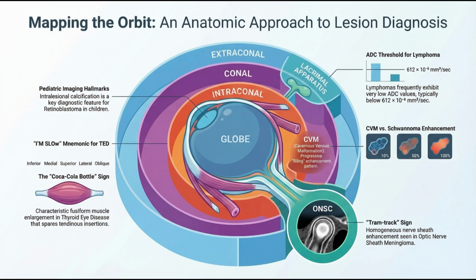Restricted diffusion. Got it. On top of that, the swelling from the stroke can cause the head of the nerve to light up intensely when contrast dye is used. Radiologists actually call this the bright spot sign. The bright spot sign. You see that bright spot combined with the trapped water molecules, and you know you are dealing with a stroke of the nerve, not MS. It's amazing how a single static picture can tell such a specific, dynamic story if you just know the language.